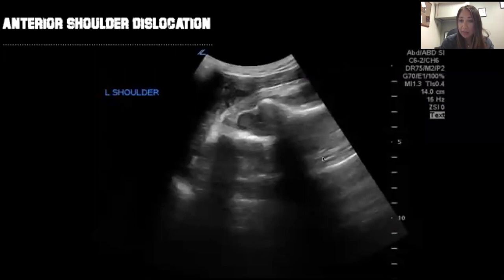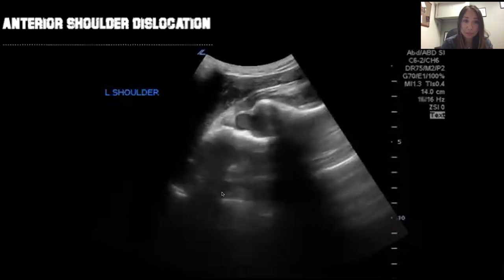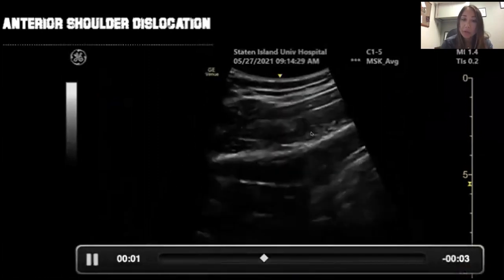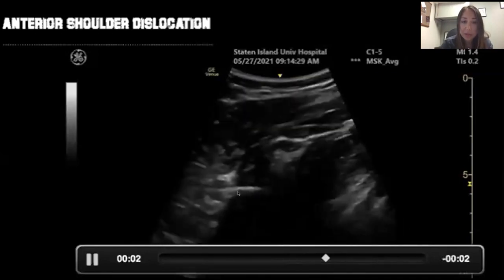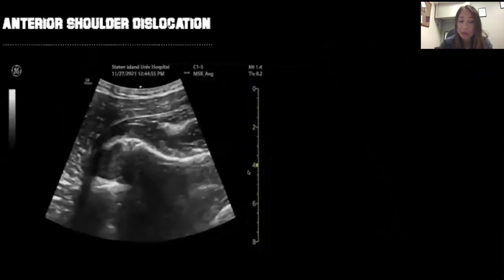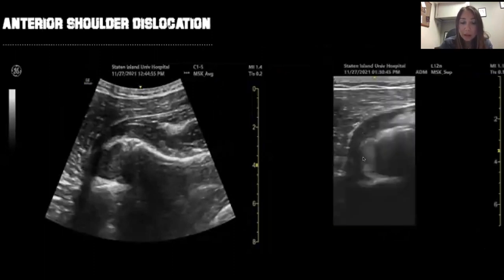With shoulder dislocations, depending on body habitus, you may need a curvilinear probe or a linear probe. Using a curvilinear probe, you can see an anterior shoulder dislocation: find your scapular spine, find your glenoid fossa, and now the humeral head is posterior on your screen, making it anatomically anterior — confirming an anterior dislocation. We compared curvilinear and linear probes on the same patient with the same anterior shoulder dislocation and you can see both clearly.